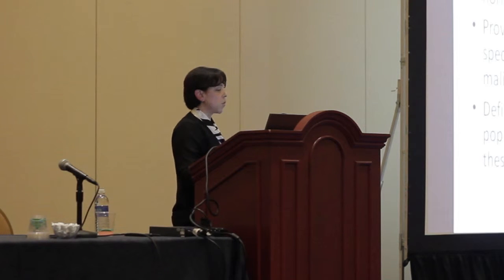For the somatic hypermutation. But beyond the detection, you also may identify in the samples both stable and dynamic aspects of the immune repertoire that differs under normal conditions and under disease conditions. It provides a very high resolution picture of the spectrum of immunity that you wouldn't see otherwise in that lymphoid malignancy if you don't do something like this. And it also defines the initial behavior of clonal tumor populations. And you can see how these clonal populations are suppressed or reemerge when you look at new samples.